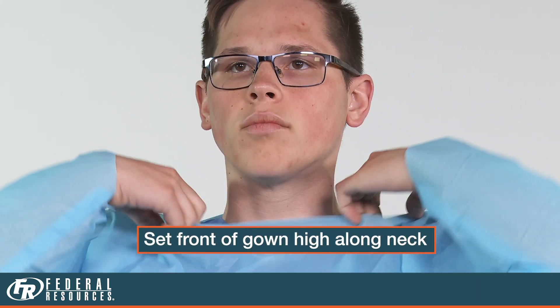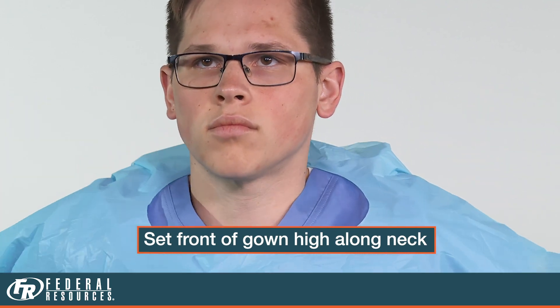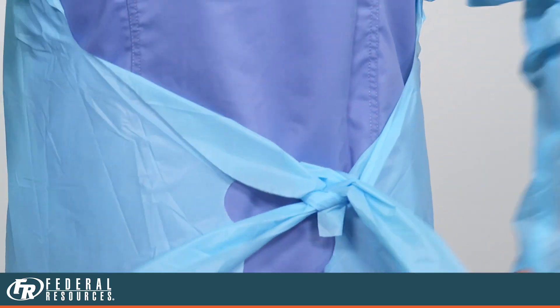Be sure to adjust the front of the gown high on the neckline. Tie your waist strings. Now you are gowned up.